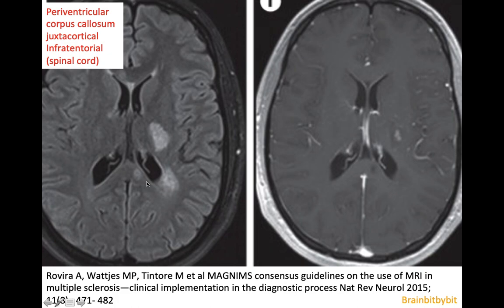This is a FLAIR image of a patient with multiple sclerosis showing lesions periventricular and in the corpus callosum, and a lesion with a periventricular orientation that enhances on the post-contrast T1-weighted image.